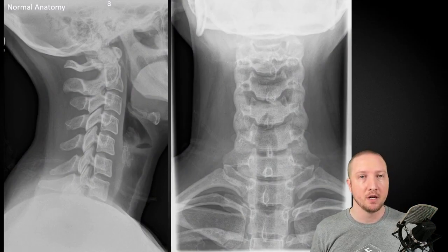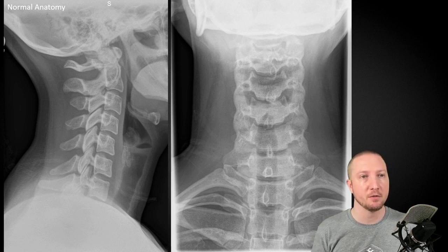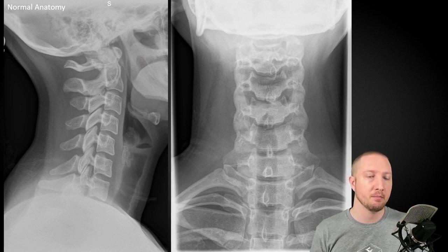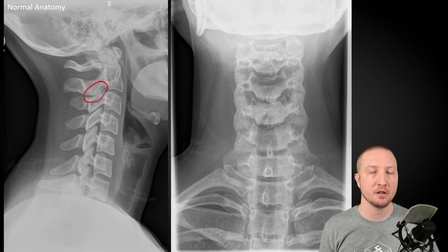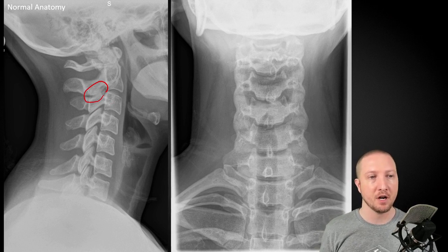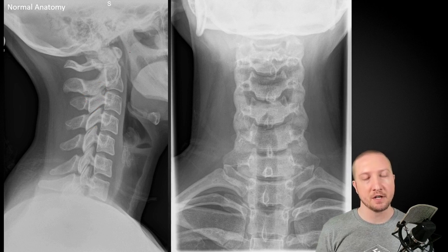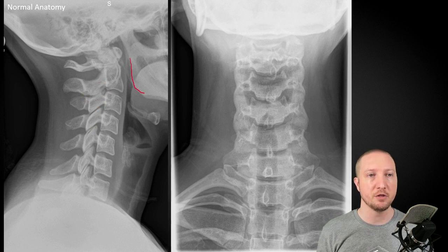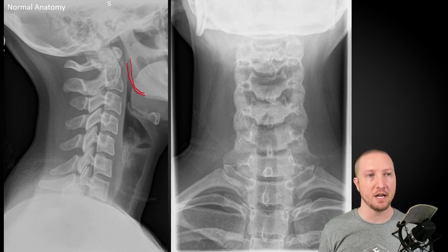Starting with some normal anatomy — a few things I like to point out frequently to interns and residents: the C2-3 facets are in a slightly different orientation, so even in a well-positioned lateral, these are often not well-visualized and can occasionally appear fused. The rest of the facets are generally well-seen. When looking at technical quality, our mandibular angles should be well superimposed, which tells us it's a well-positioned lateral without too much lateral flexion or rotation of the head.